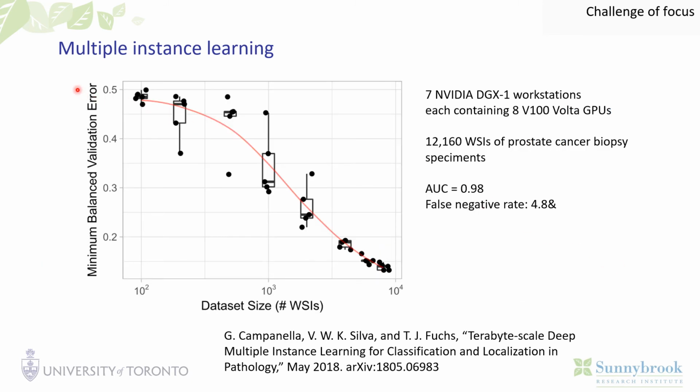And they showed that if you have enough data, then this works quite well. So they showed that for data sizes of 10 to the 4 images, you could actually get quite good error measurements, whereas if you had much smaller data sets, then this doesn't really work very well. And that's actually what we found as well. You do actually need a lot of data to make this kind of brute force algorithm work.